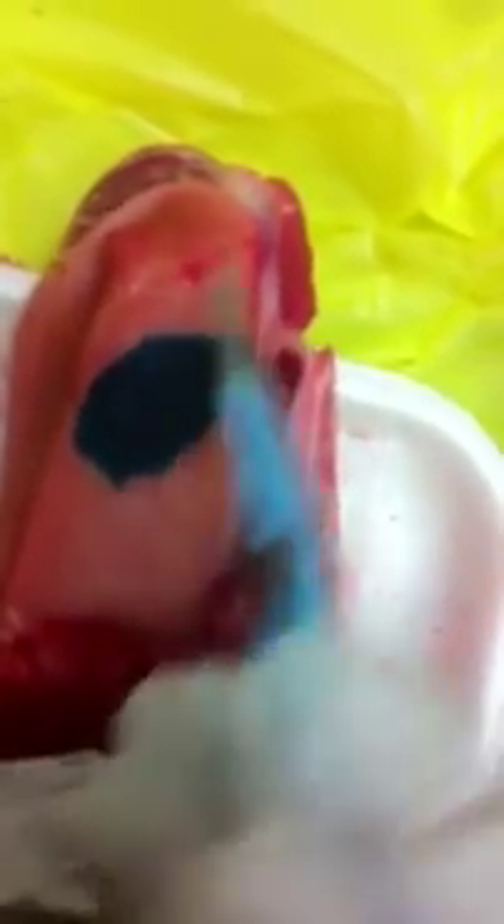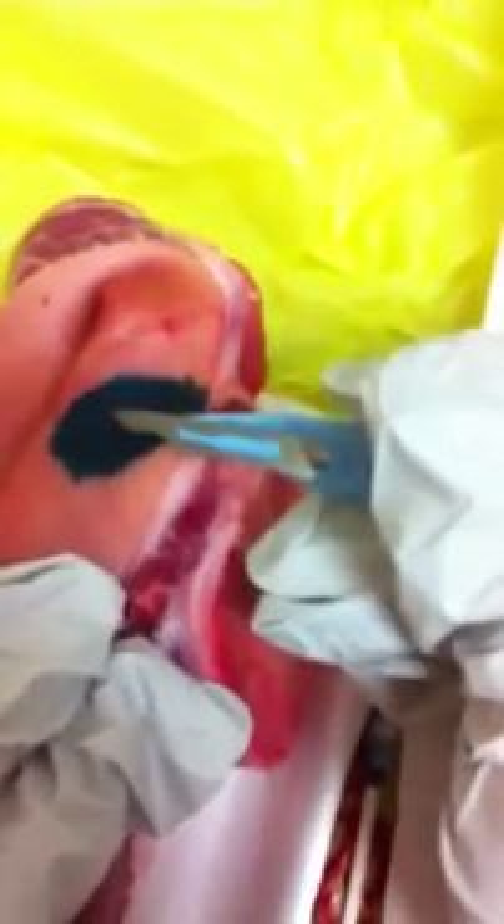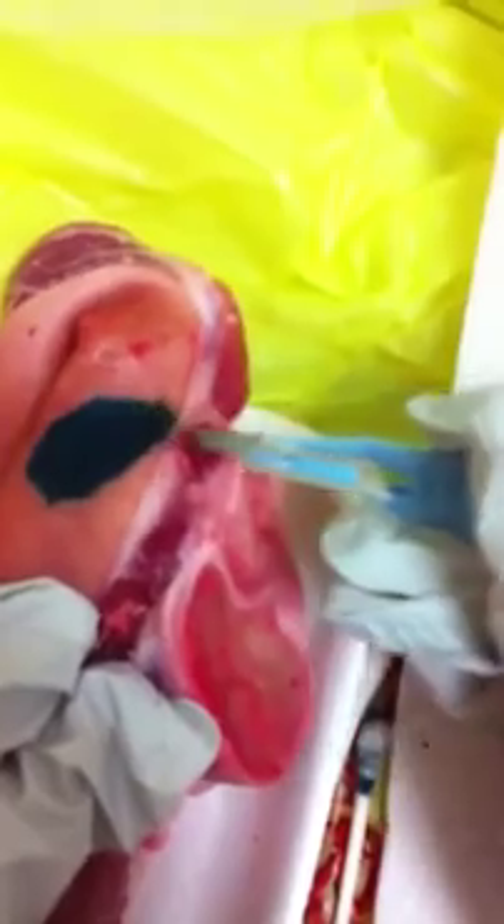Those cuts were made and we still don't see the viable tissue there. You can see it's not the viable tissue — it hasn't been reached. I'm pulling them apart and you can see that the light blue color shows it's still not very deep, and that's how it should be.